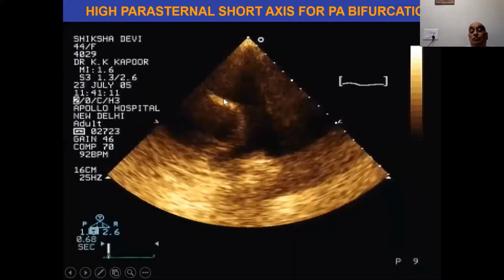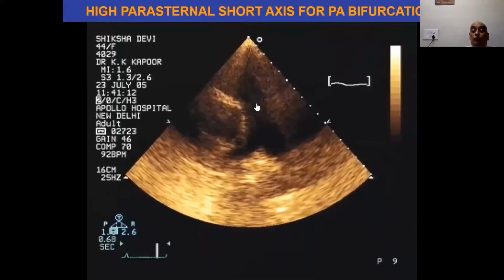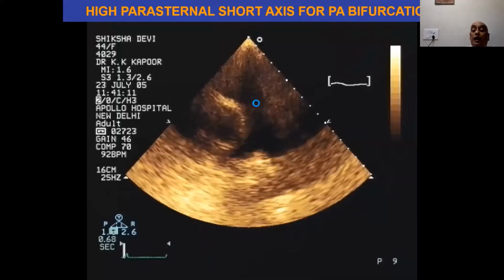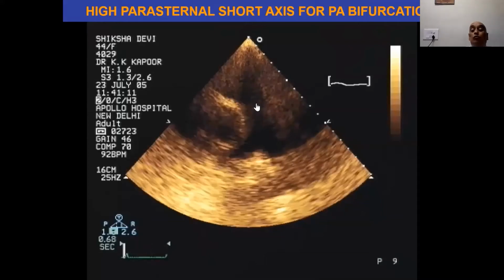Now, this is the high short axis view. You can see the moving clip of the right short axis view: the right pulmonary artery, the left pulmonary artery, and the aorta. It is a very important view to look at the PDA and at right and left pulmonary artery stenosis, the bifurcation of the pulmonary arteries, and the continuity of the main pulmonary artery with the right and left pulmonary arteries. That is a very important point sometimes in congenital heart disease, whether the pulmonary arteries are confluent or non-confluent.